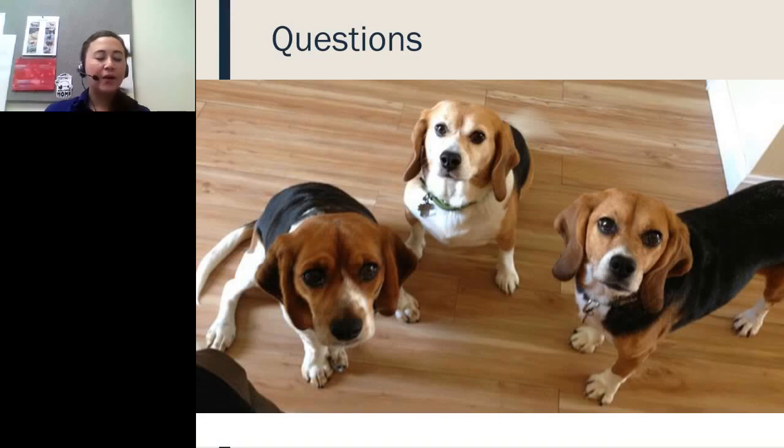So our thought with regard to the difference between dog and cat is that we're working on teasing that apart a little bit more. But what I'm thinking is that it's due to a difference in rigidity between dog and cat tissue. If anyone's had experience cutting through an ovary of a dog versus a cat, the cat is like cutting through a ripe pear, whereas cutting through dog tissue can be more like cutting through an apple. It's much tougher, so I think this tissue is more fibrous, or certainly more rigid. That is possibly the reason why it's not responding as well, particularly in ovarian tissue culture, for follicle growth. It may be that rigidity has been messed up somehow.